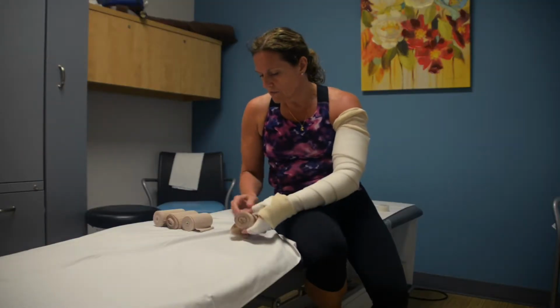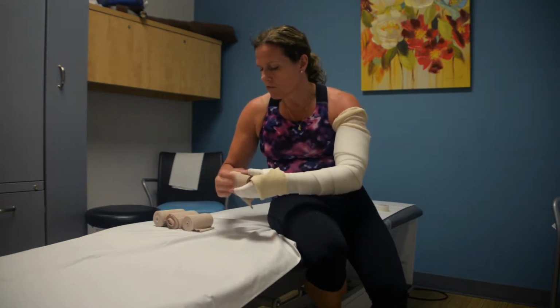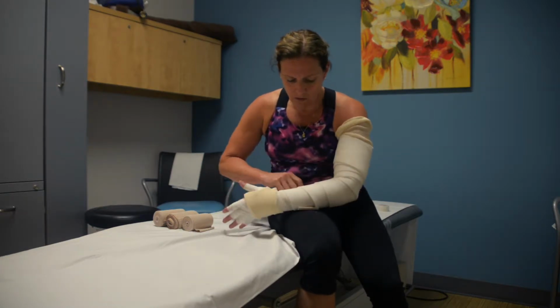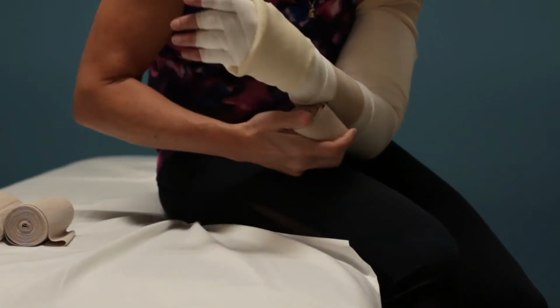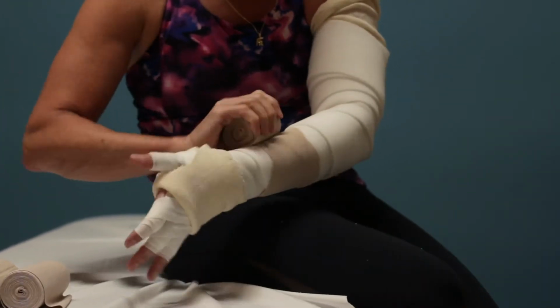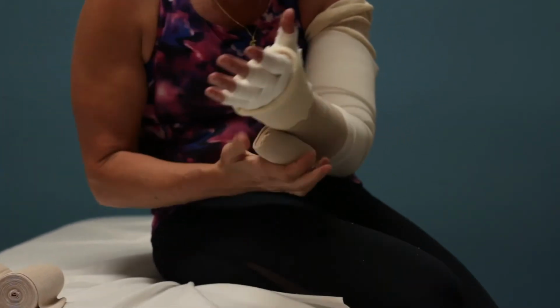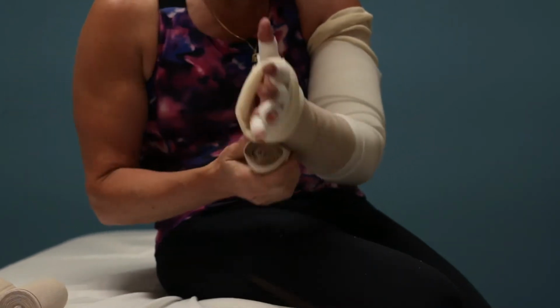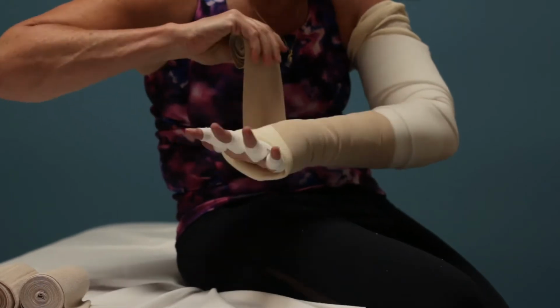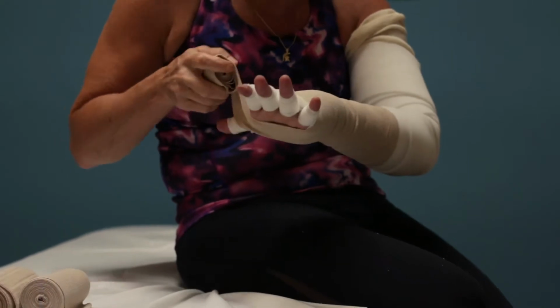So I've got these lined up: 6 centimeter width, 8s, and 2/10. So your first bandage is going to start in the lower part of the forearm. So really just one time around. You're going to come down, and your first bandage is really your hand bandage. I'm putting about 25% of the available pull on this short stretch bandage. I'm going to come all the way down into your hand. So you're going to go 3 times around your hand.